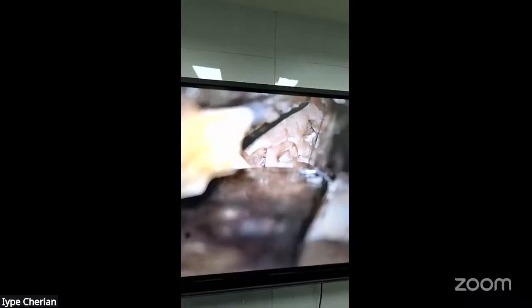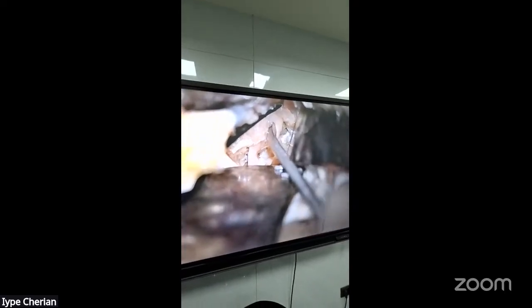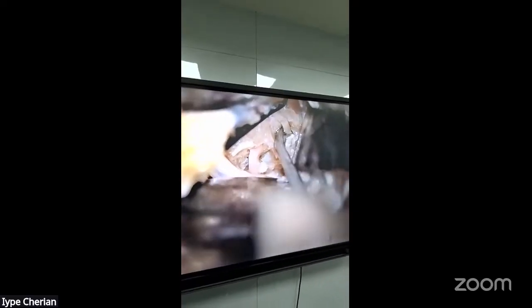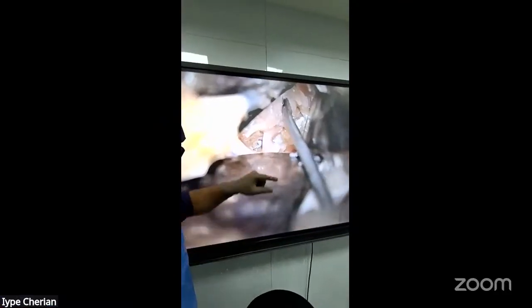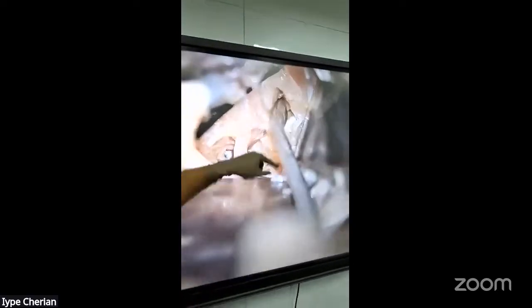That is the sixth nerve. You can see this one. There we go. That is the most important view right now. This is the C5 carotid, pointing with his finger. And C5 is below this. This is C5, the carotid is there, and this is the best shot right there.